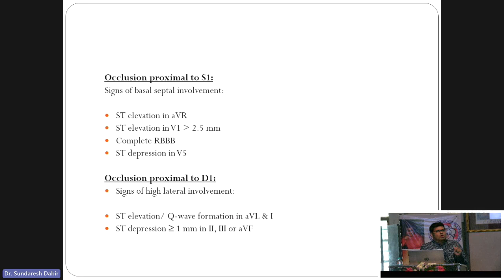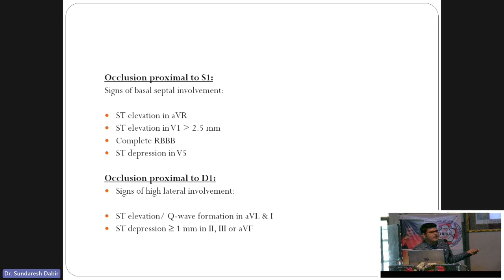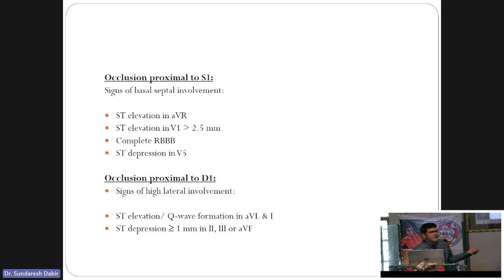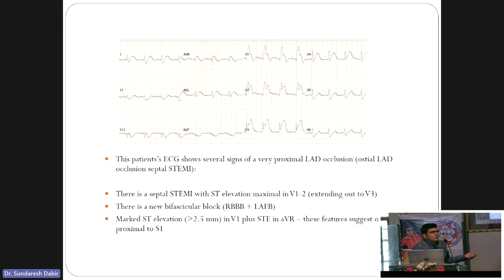For occlusion proximal to S1, there would be elevation in V1 and aVR, with complete right bundle branch block — called RBBB pattern — and reciprocal ST depression in inferior leads and V5/V6. Always look for depression when you see elevation, in the reciprocal leads. An example ECG shows elevation in aVR and V1. If V1 elevation is more than aVR, it is probably LAD. If aVR elevation is more than V1, it is probably left main disease.